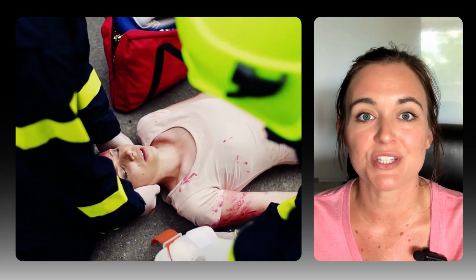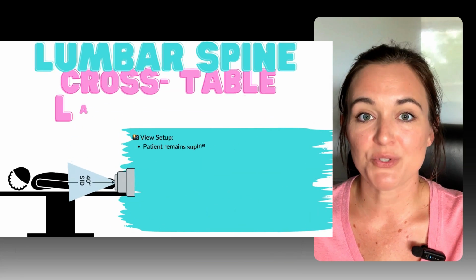All right, now let's shift gears and talk about the trauma lumbar spine series. You've got a patient who's been in a car crash, or maybe they fell from a ladder, and you get the order: lumbar spine trauma protocol. Let's talk through how we approach this safely and how to get the images the trauma team actually needs without risking your patient. Positioning principles first.